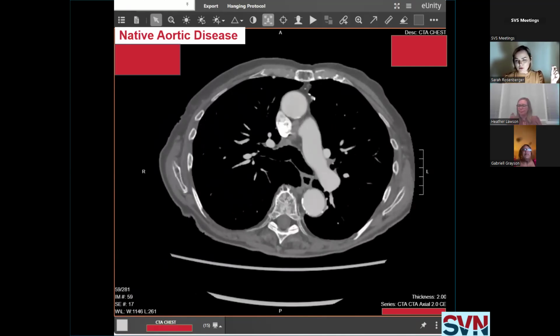And not everybody's normal size aorta is exactly the same size. Just like we are different heights, we have different size feet, people have different size aortas. A 6'6" male is likely to have a larger normal aorta than a petite 5-foot female. And so a good rule of thumb that I like to use is the vertebrae should be about the same size or bigger than your aorta. So even with a cursory glance, as I watch the spine compared to the aorta, I can tell whether or not it's about the right size by comparing it to the spine.